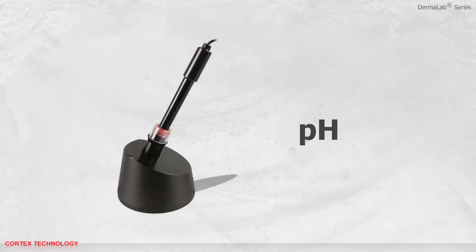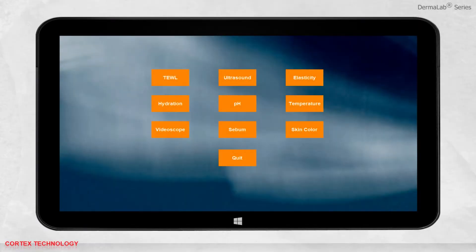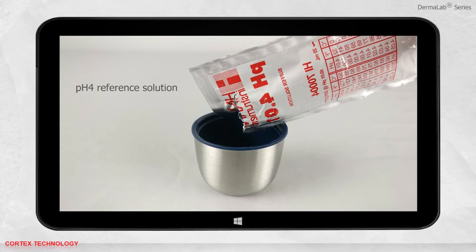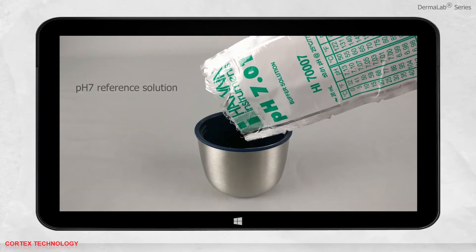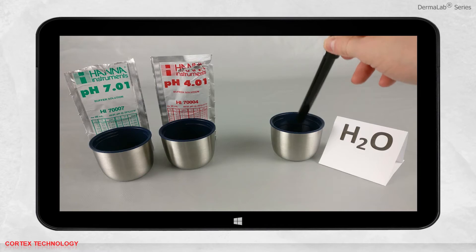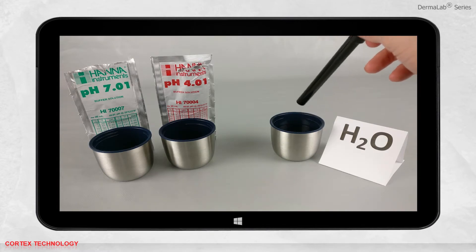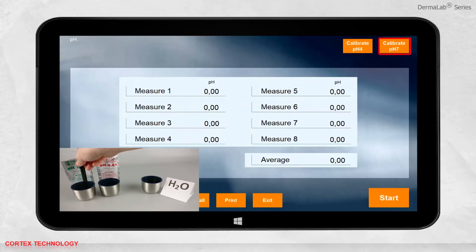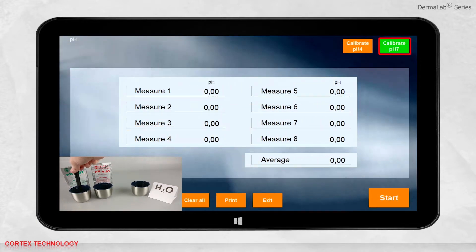pH application. Select pH. Before you start a measurement, be sure that the probe has been calibrated recently. To calibrate the probe, you need pH 4 and pH 7 reference solutions, which come with the probe. You also need a glass of water to clean the probe between each calibration. Always start with the pH 7 solution. Insert the probe in the pH 7 and press calibrate in the software.